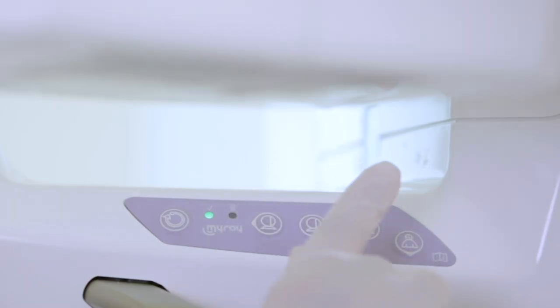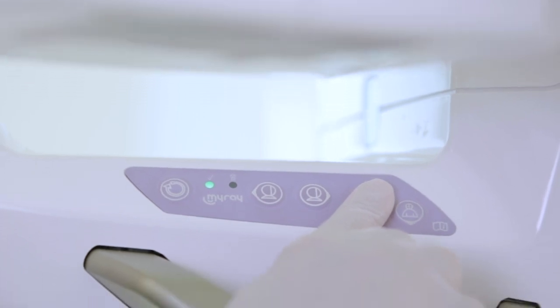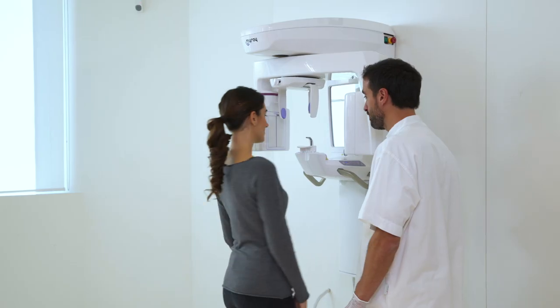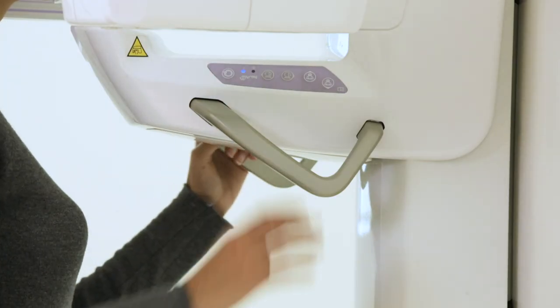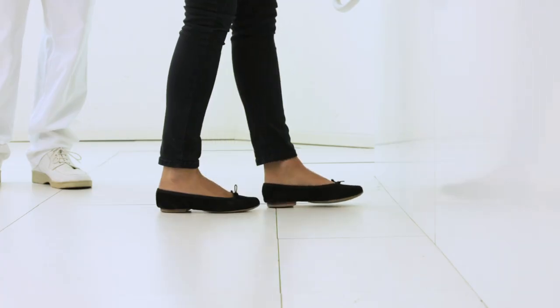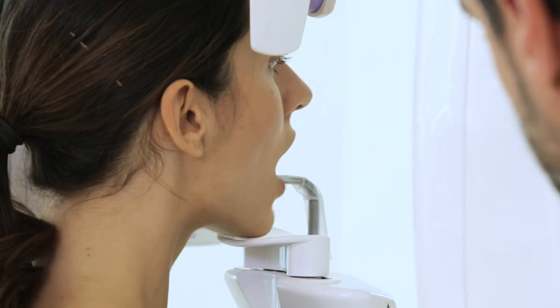The first operation adjusts the height of the device. This is done from an onboard keypad. Once the correct height has been reached, the patient grabs the handles and rests her chin on the chin rest.